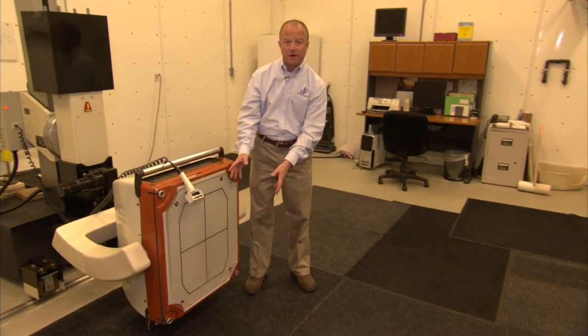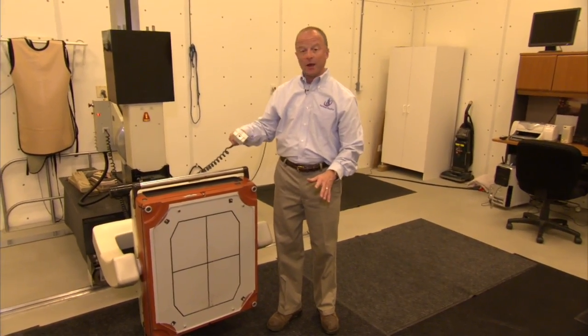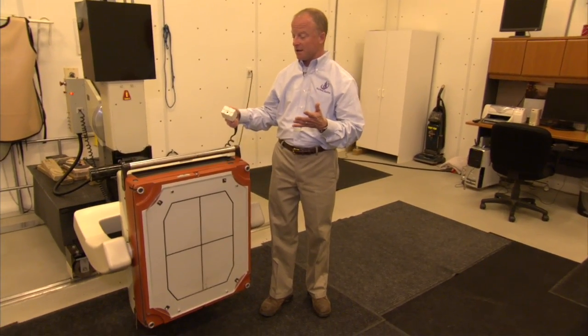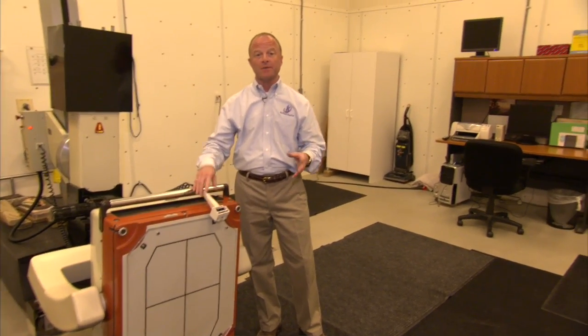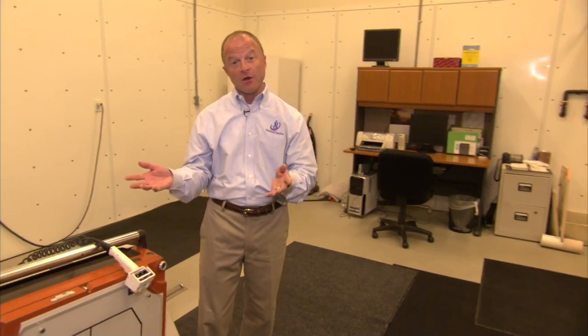And the horse stands in front of it, and we're able to adjust the machine up and down. We can go up, we can slide it left and right, we can rotate the camera, and we can take images of their entire body. And in the end, what it's looking at is the radiation counts coming from their bones. So if there's an area that's injured, it shows up as a really dark hot spot. And then from there, we're able to go ahead and treat those areas.